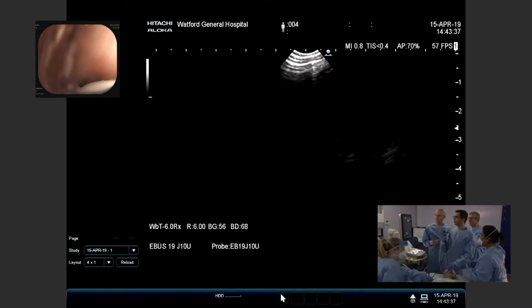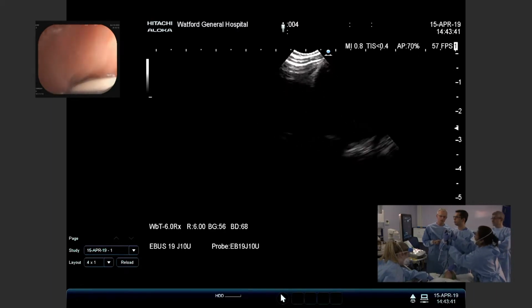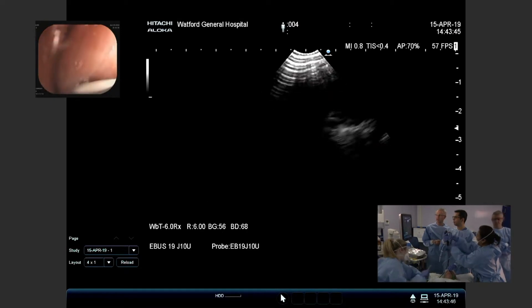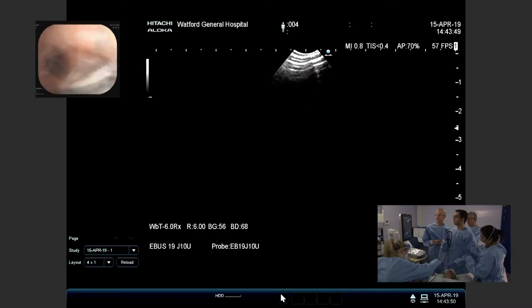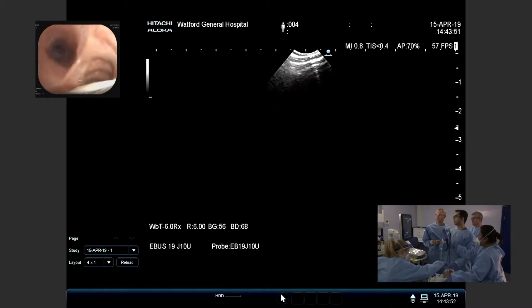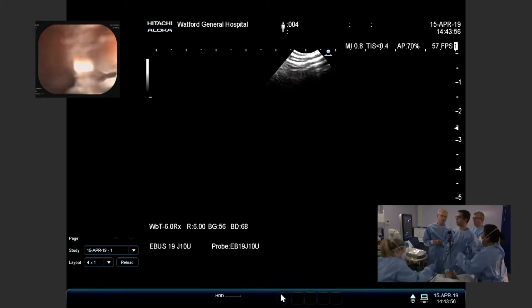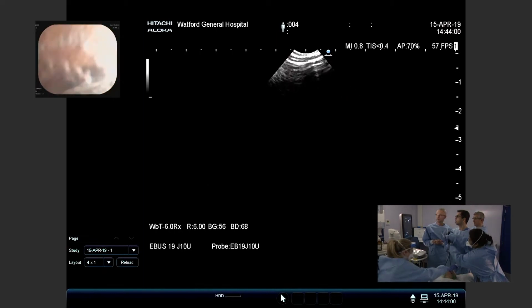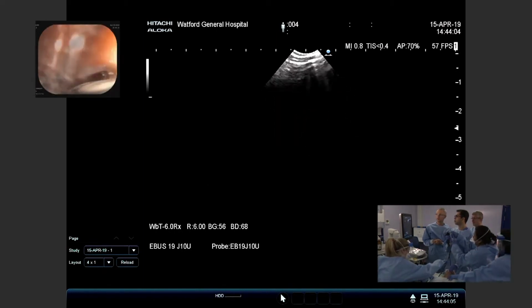Yeah, go for it. So here you're administering local anesthetic down the left main bronchus. Indeed. Okay, dear. Just putting extra local anesthetic. Again, as I said, it does make you cough for a couple of minutes and then it settles down. Another one, please. So Dr. Mogul will be approaching this case with the view to both stage and diagnose.